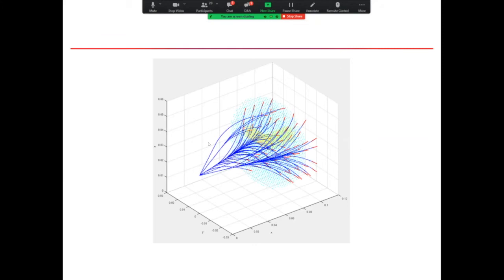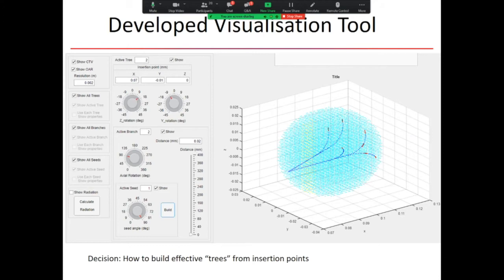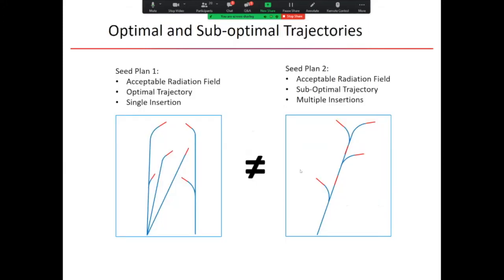Okay, so as I mentioned, the system can generate the different scenarios, and based on that can optimize the best approach. And you can see here the transverse plane versus the frontal plane view of the path from the root. This was developed into software, which was embedded in MATLAB, and this is the user interface where you can set the different parameters. On the right side is the outcome of the program, which shows the path of the needle itself. So it can look at whether single versus multiple, and the accuracy and the efficiency as well.